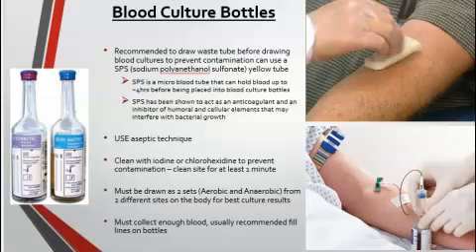This tube can be used to empty into the blood culture bottles if needed. But if blood is emptied from the SPS tube into the blood culture bottles, the blood should have only been held in that SPS tube for only up to 4 hours. Some things to note about the SPS additive is that it's shown to be an anticoagulant, and it can be an inhibitor of some cellular elements, and it can interfere with some bacterial growth. So it might be better just to go ahead and collect your blood cultures directly into your blood culture bottles.